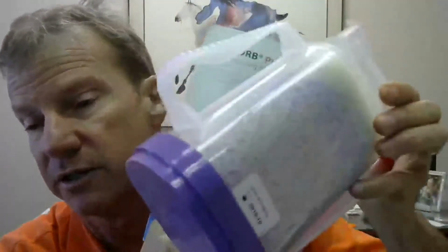So let's say you go to an account, they say, oh, we're using Medisorb, and we have a combination of Estiva machines, which I know Estivas use the canister, and we have some newer machines that are Aspires and GE ACES machines, so that means they're using the beer mug machines. I would ask them once again, well, how are you changing your absorbent? Are you changing it based on color change? And they might say yes, and once again you ask, when do they change it?